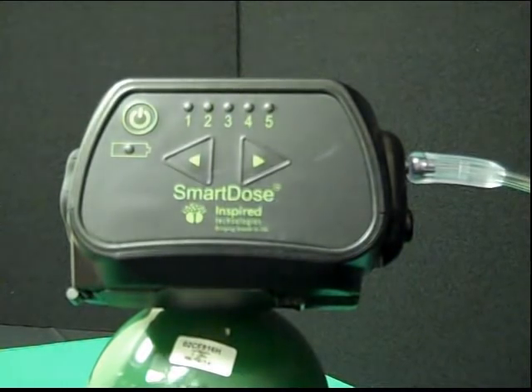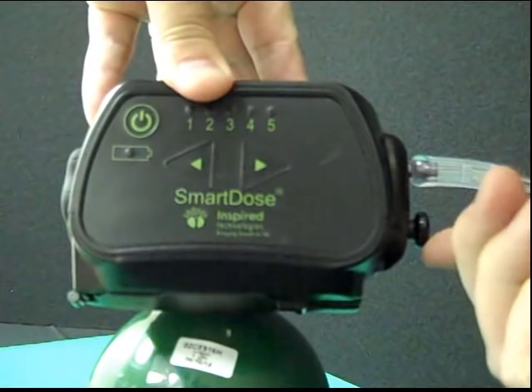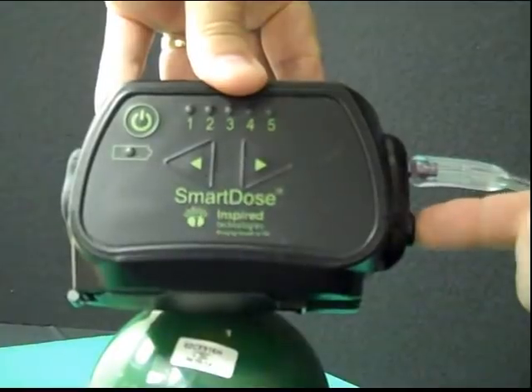To place the SmartDose gas port into continuous flow at two liters a minute, simply pull out the black knob on the side of the unit. Push it back in to change the delivery mode back to SmartDose pulsing.